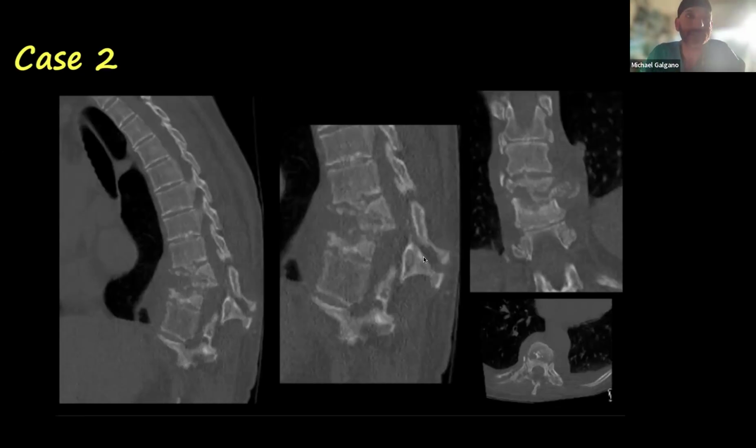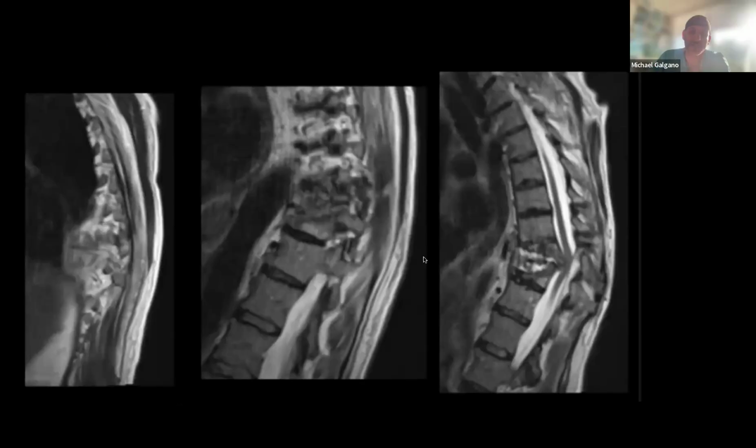Wendy, any thoughts about this one? Again, the bones, it's obviously an infection case, but at the same time, you see that osteonecrotic cleft in the upper deformed body. So it almost makes you think that that was already kind of dying bone, like more of a chronic infection, maybe? I don't know. Yeah, I think a lot of these infection deformity cases, they almost all are chronic, right?